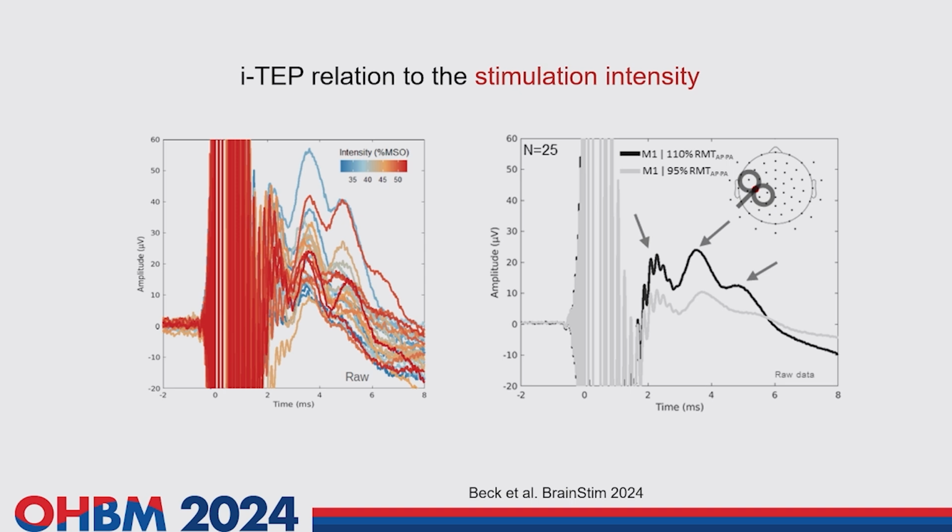On the other hand, it's related in the single subject, in the sense that the higher we go with the stimulation, as you can see on the right side, the higher is the response in the single subject, which, in a sense, might tell us that this is not an artifact due to the electromagnetic induction.